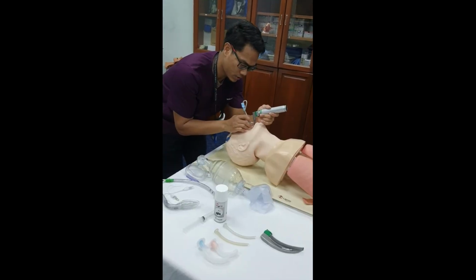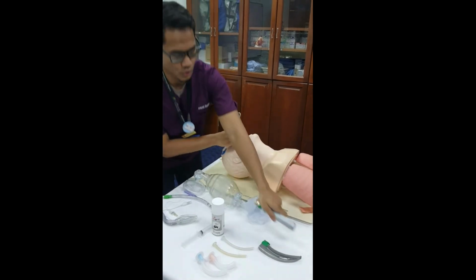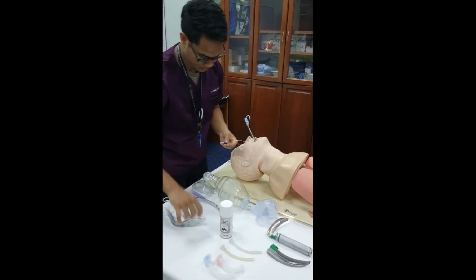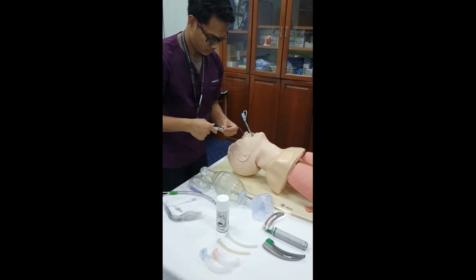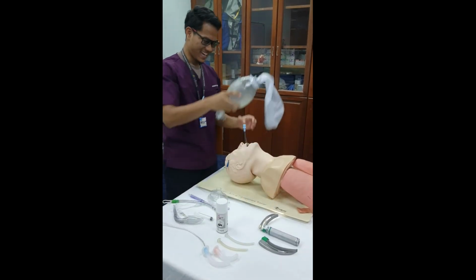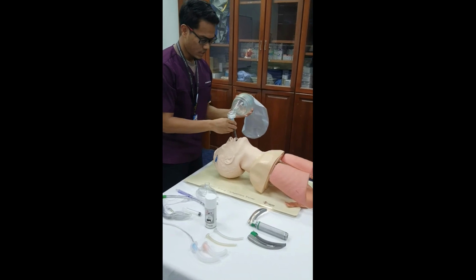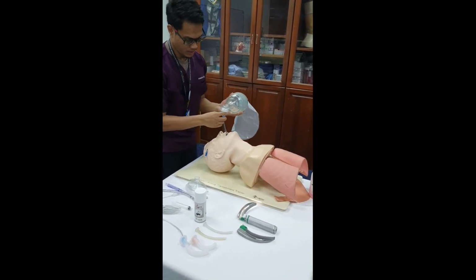Insert the ET tube until 23 cm, and then we take out the laryngoscope. Then we inflate the balloon. Then we check. So it's correctly placed.